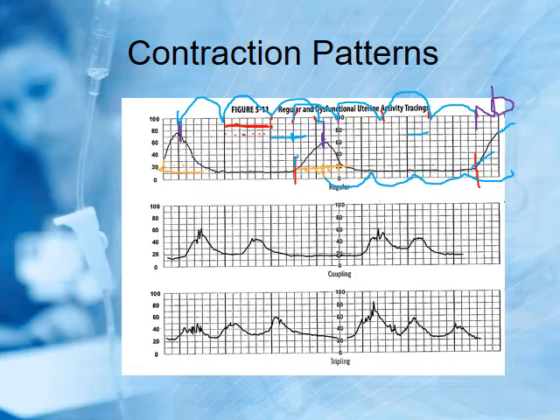Now down here, let's see what we're doing down here. We've got the peak here and okay. Develop a pattern to report to a physician. You'd want to say she's contracting every so many minutes, lasting how long, and how strong they are. Kind of develop that pattern. So I always look first for how often are they happening. So it's peak to here to a peak here.